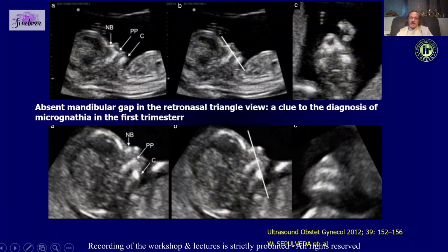Typically when you look at the retronasal triangle there is a gap known as the mandibular gap. If the mandibular gap is absent, that could be a clue toward the diagnosis of micrognathia. So this is one more thing we can pick up with the help of the retronasal triangle.